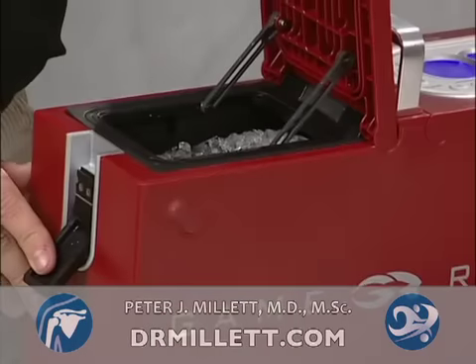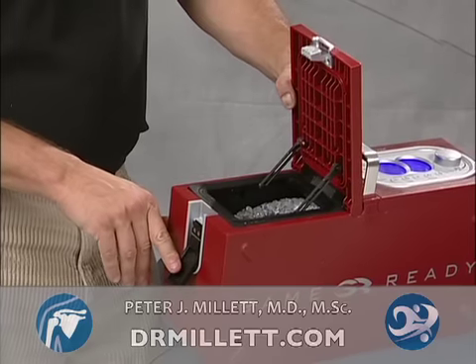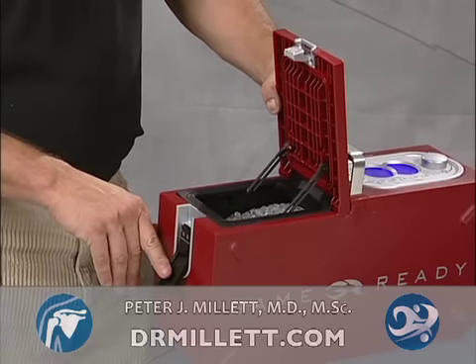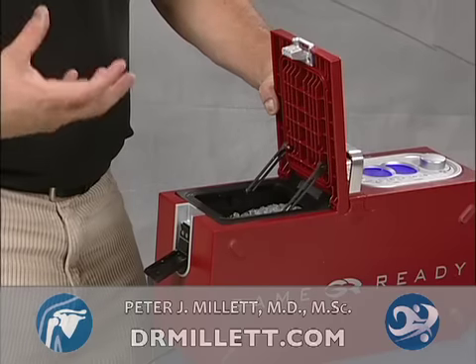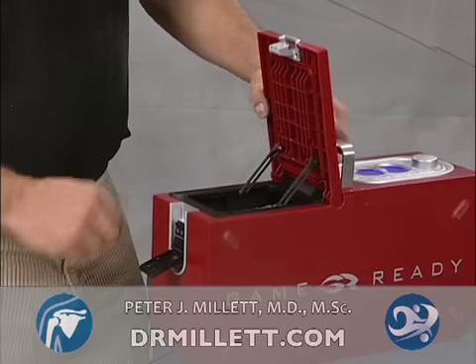This is the basin where you add water and ice. It is recommended you add about 2 inches of water and fill the rest with ice. Dixie cups filled with ice or large ice chunks will last longer for the unit.